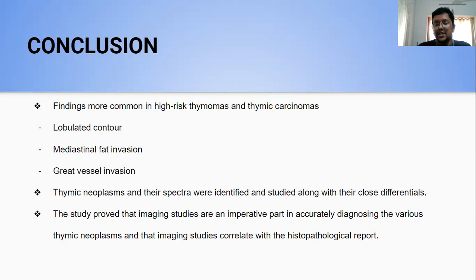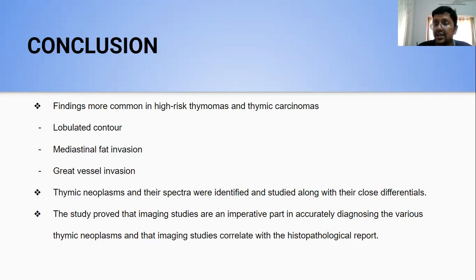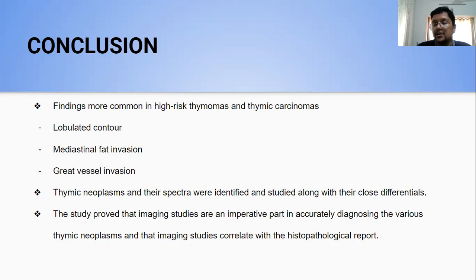From the cases presented, it is clear that findings more common in high-risk thymomas and thymic carcinomas include a lobulated contour, mediastinal fat invasion, and great vessel invasion. Type A thymomas are more well-defined and well-encapsulated, with no calcifications, no vessel infiltration, and no bony erosions. B-type thymomas showed more calcifications. Overall, we were able to identify the types of thymomas from radiological imaging, which correlated well with the histopathological reports. We also considered close differentials of lymphoma and tuberculosis when reporting thymic neoplasms. The study proved that imaging studies are an imperative part in accurately diagnosing various thymic neoplasms and that imaging correlates with histopathological findings.